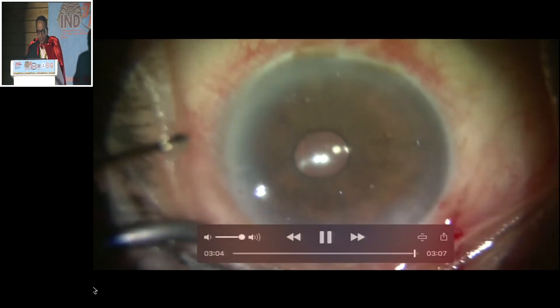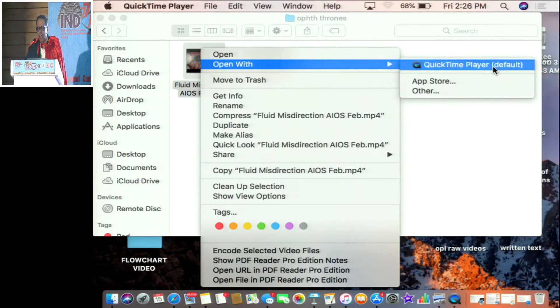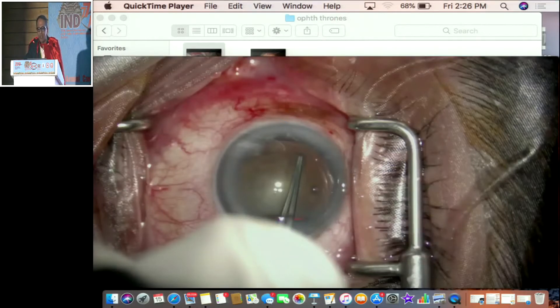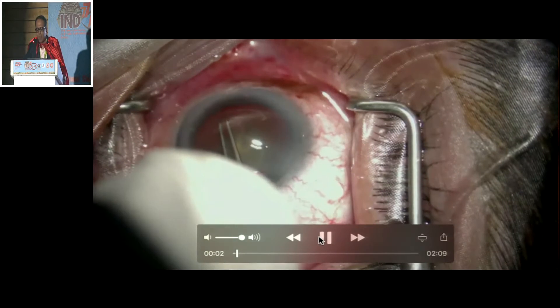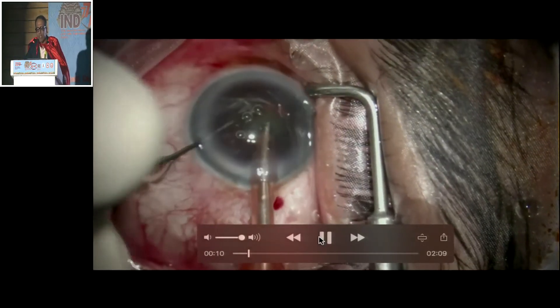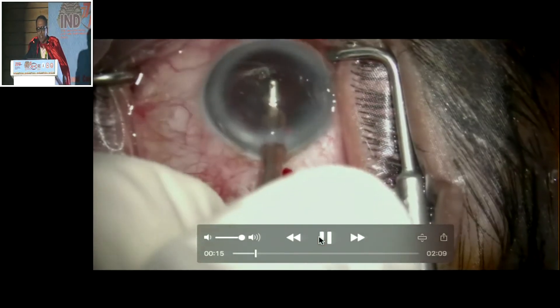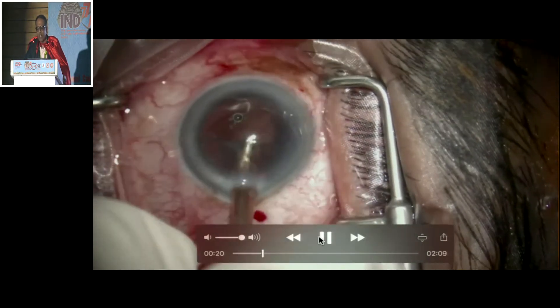Now comes the next case. This is a patient who has fluid misdirection syndrome, which comes in our surgical life once in a while. The case started in the routine manner — I was talking with the patient, who was comfortable since this was the second eye. Nucleus emulsification was carried out in the routine way. When the IA started, I suddenly realized that the posterior capsule had become flat.